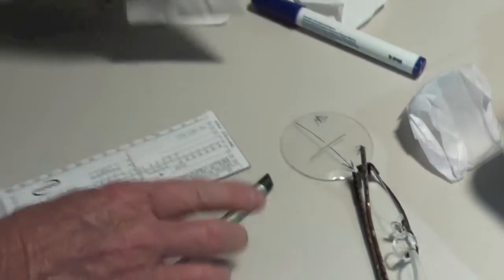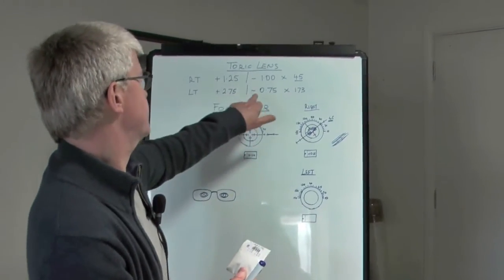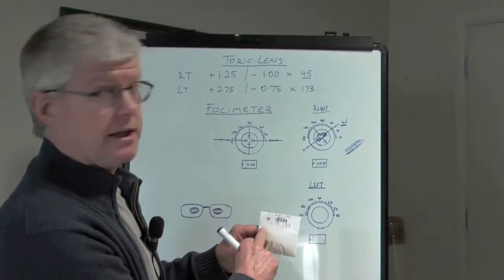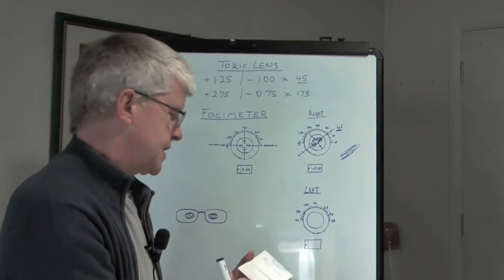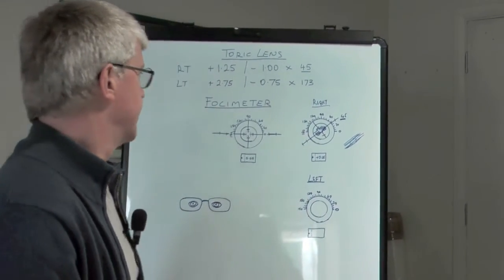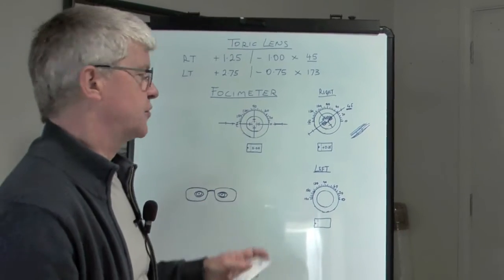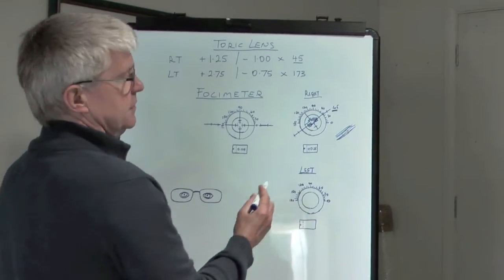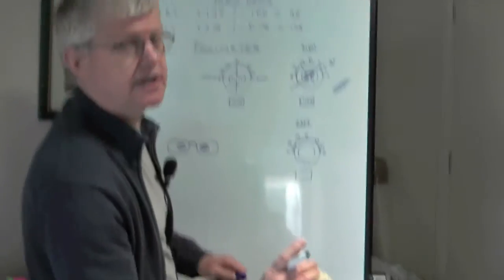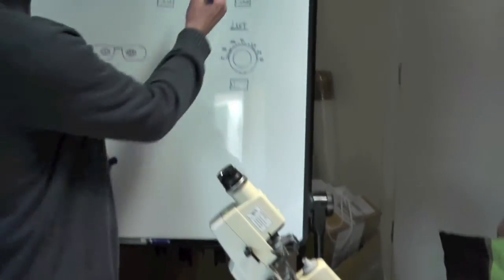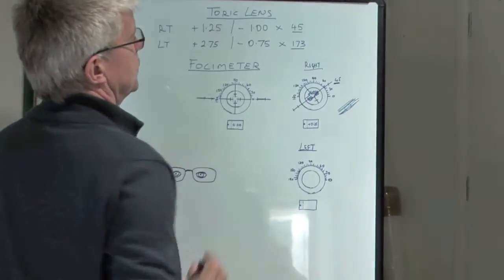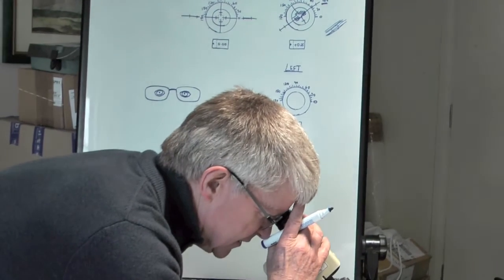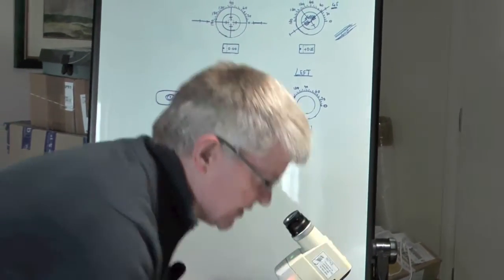Now we're going to do the left lens. We've got plus 2.75 minus 0.75, which is what we've got on the lens packet here. We're going to do exactly the same thing again. First of all, we set the axis using this dial here. We want an axis of 173. So I'm going to set the axis now at 173.